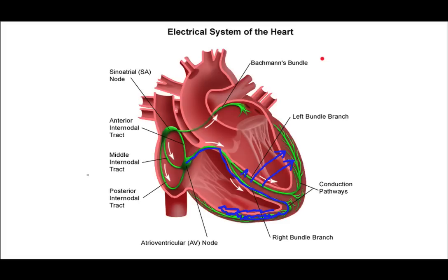If you were over here in V1, on the V1 side of the heart, and you were looking at that lead, what you would see in this case, I'll do a P wave here, what you would see would be a negative QRS. That's because you're over on the right side of the patient, and the main wave of depolarization, which is going through the left ventricle, is going away from you. So you get a negative V1.